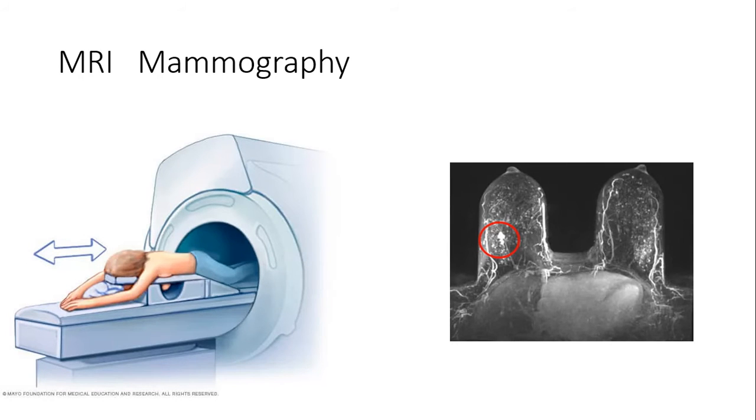And there is one more type of mammography, the MRI mammography. MRI mammography is a very costly procedure. It is not easily available in every city. Right now, some centers in Jabalpur are doing MR mammography.